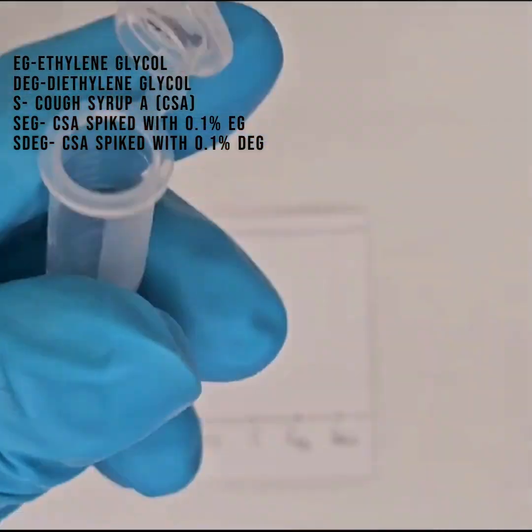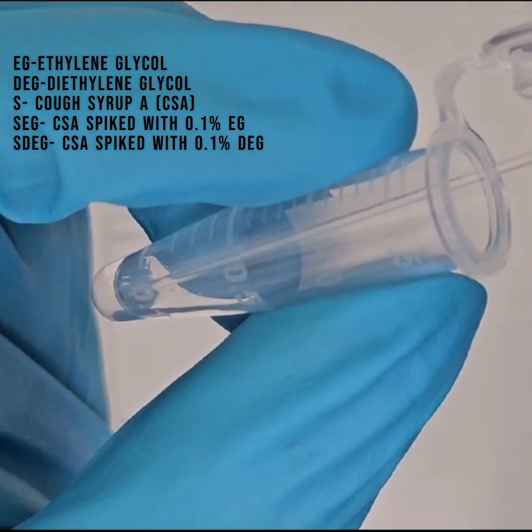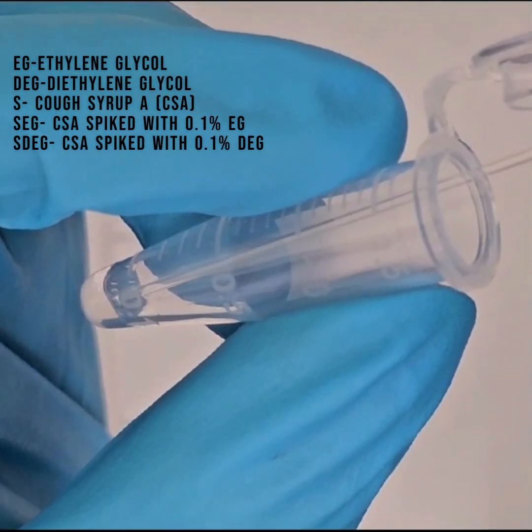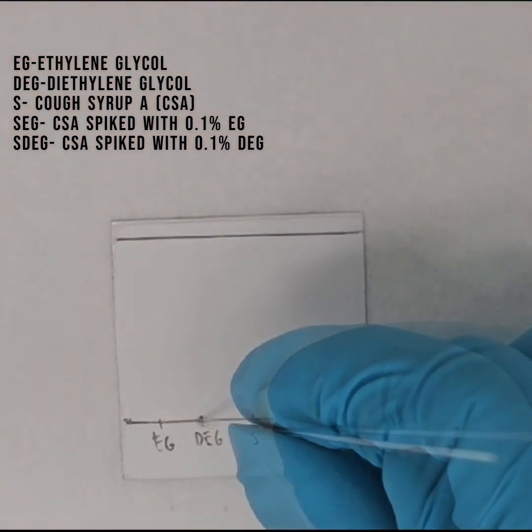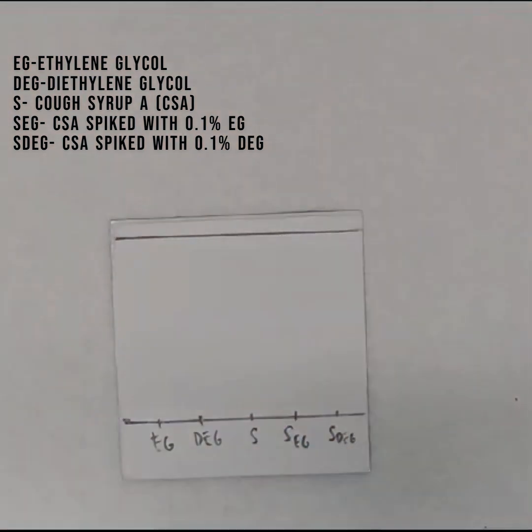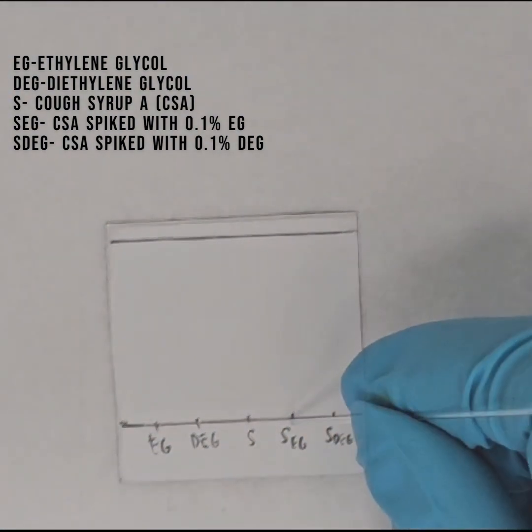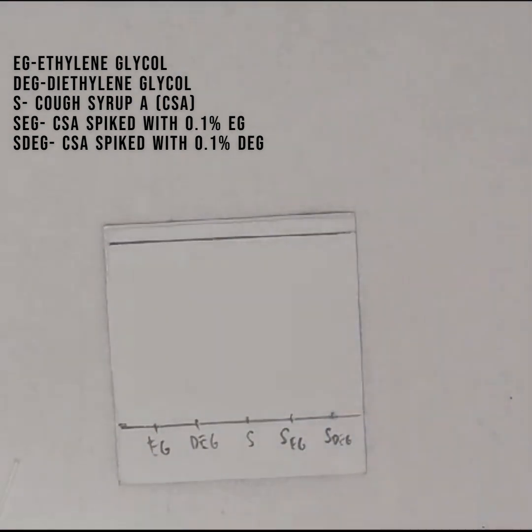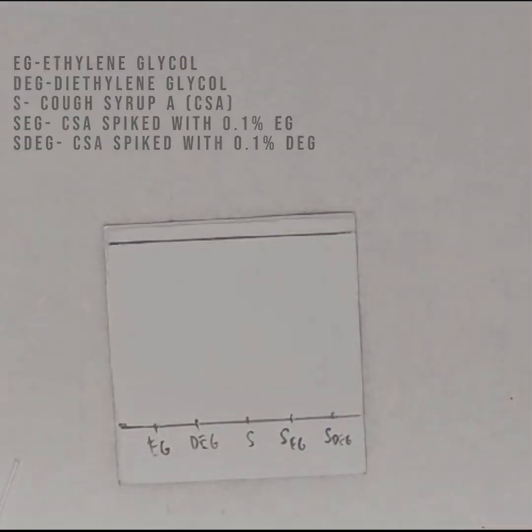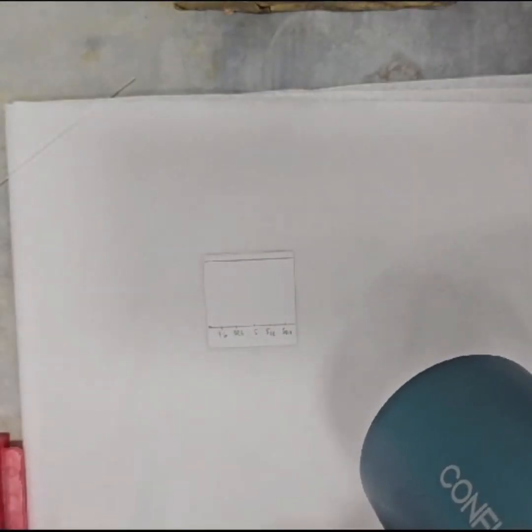This is how our plate is set up. Our first two lanes consist of pure ethylene glycol and diethylene glycol, which are standards. Cough syrup A is in the middle lane, and the last two lanes comprise of the cough syrup spiked with ethylene glycol or diethylene glycol with respective concentrations shown. After spotting the plate with the samples, use a hairdryer to ensure that the TLC plate is dried completely.